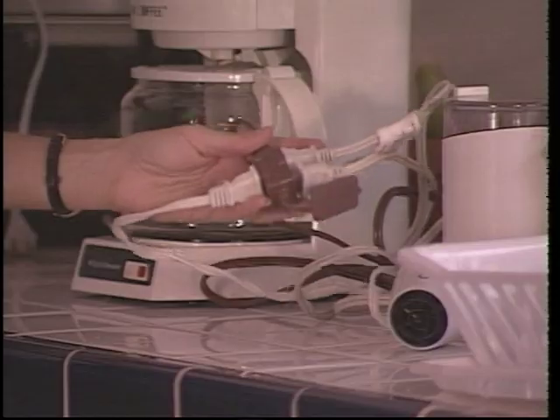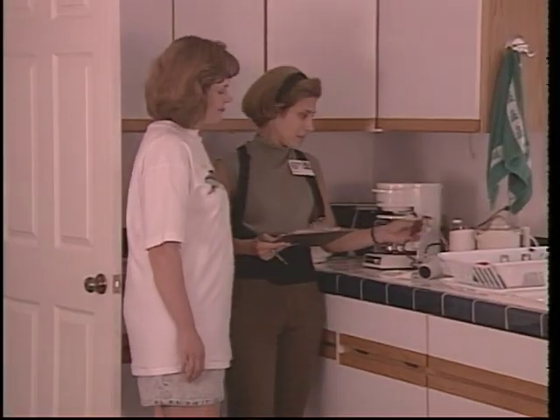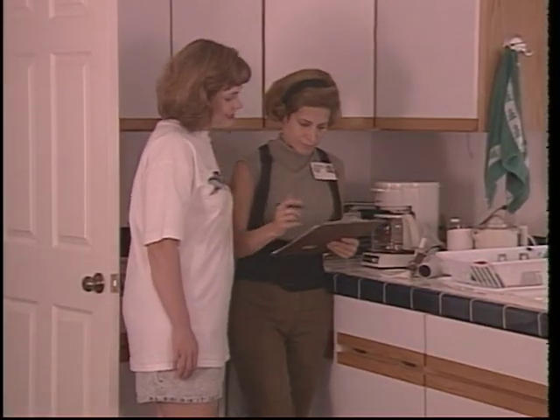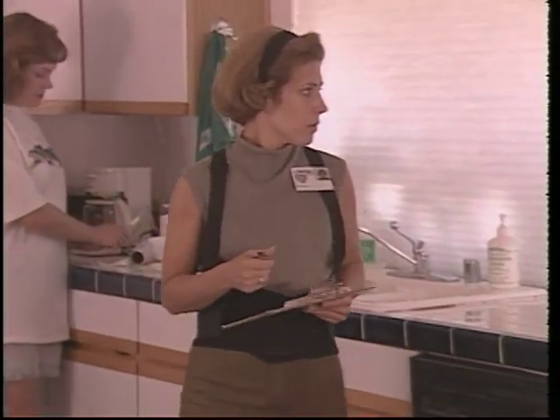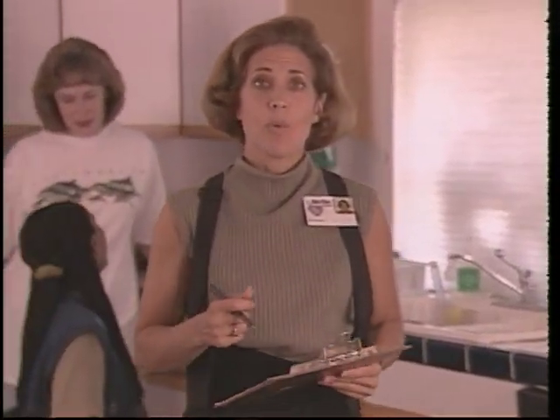Now, it's not a good idea to have this many cords on a kitchen outlet. Assessing the home is an essential step when initiating home care for patients requiring mobility aids. In this video, we will demonstrate the importance of a thorough home assessment as it pertains to the three most commonly used mobility devices: canes, walk aids, and wheelchairs.